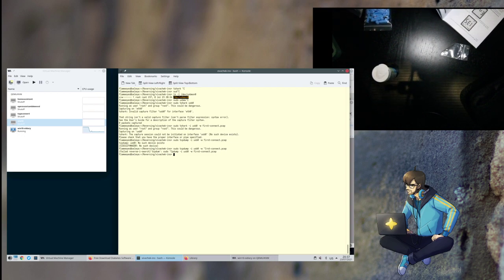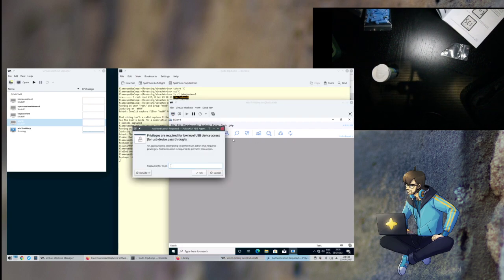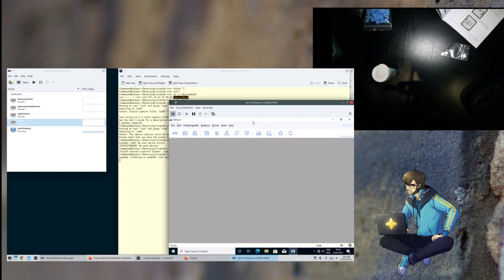Set a FACL, yeah, sure, all of those things. Do I need to say usbmon zero? Yes. So the good thing is that usually here I now will have a lot of stuff going on because I'm typing and I need to do things carefully because I move my thing. Because I'm using RDP, this is not going to get anything until I actually connect the thing. So now it's capturing and I'm connecting the device. And asking me for a password for device pass through, which, yes, that's what I want.